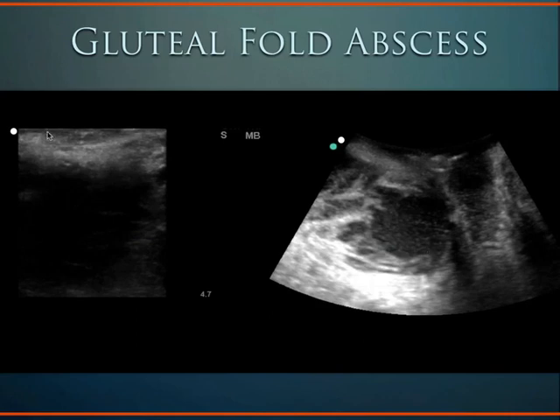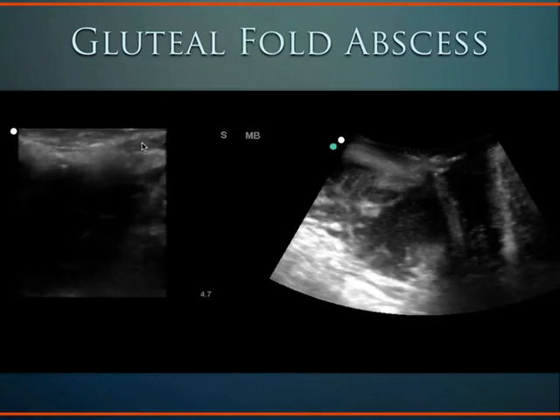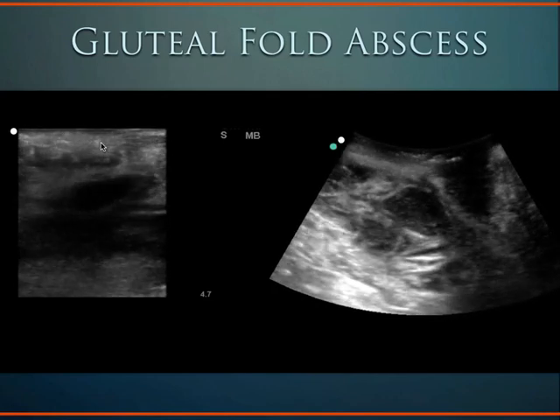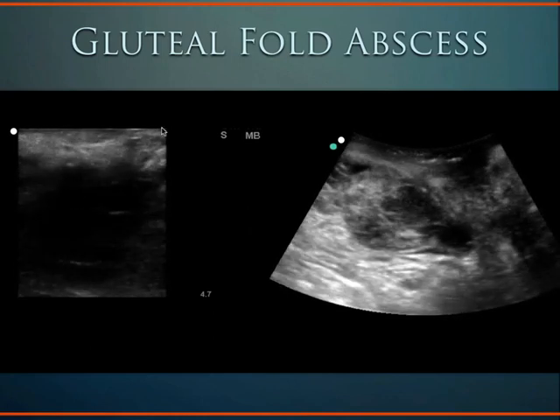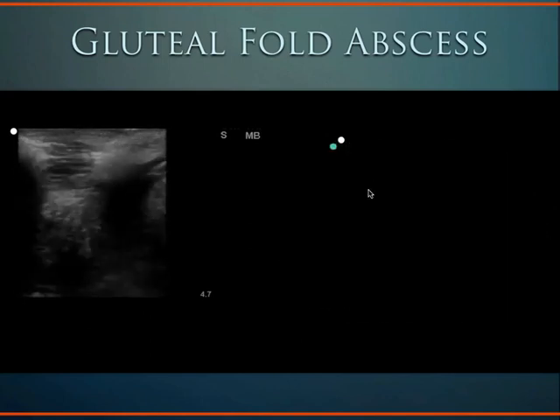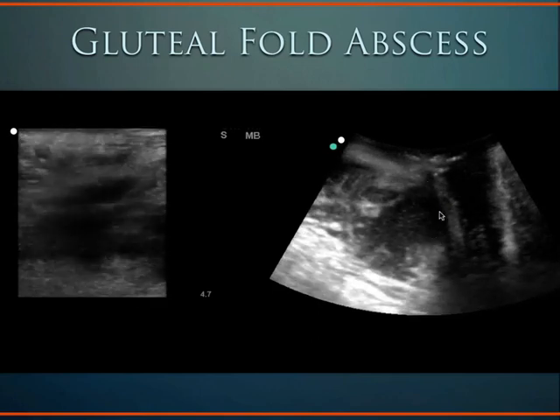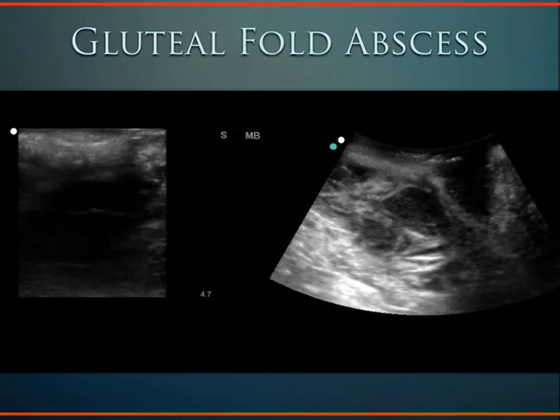Interestingly, on the skin line, there was no evidence of any cobblestoning or cellulitis at all, just normal soft tissue here. His skin wasn't even red. He just complained of severe low back pain. In fact, the resident taking care of the patient ordered some x-rays which were negative. They didn't see any evidence of abscess on the x-rays, which you wouldn't expect to. The bones looked okay, but it wasn't until we did this ultrasound that we saw he had this severe abscess there.